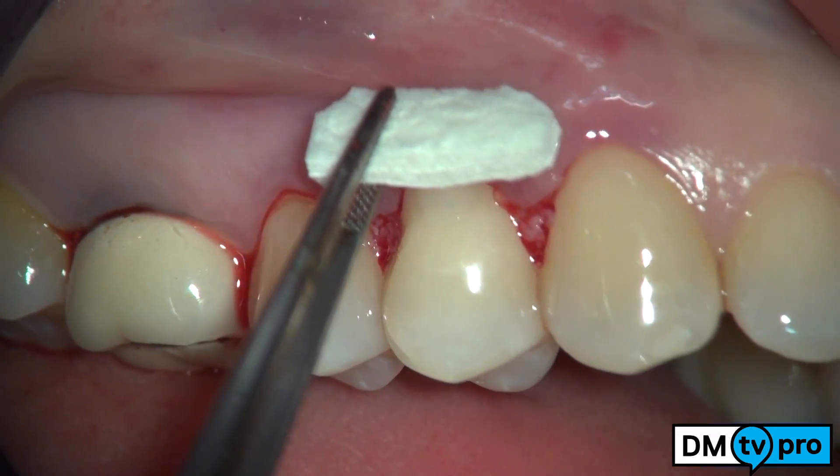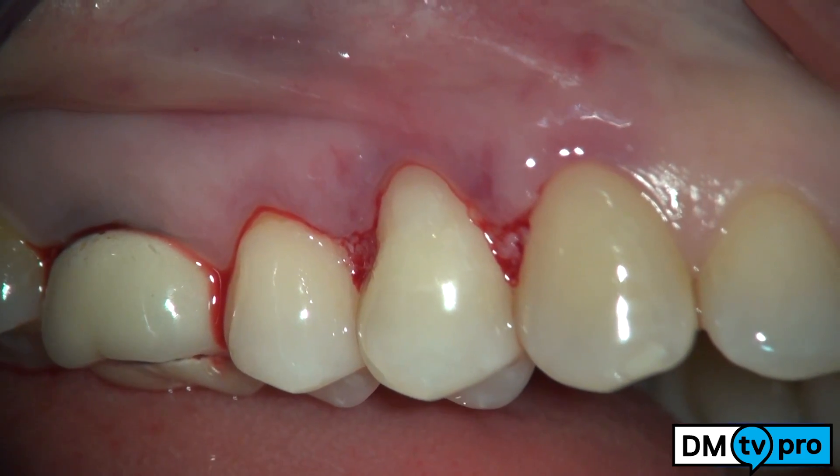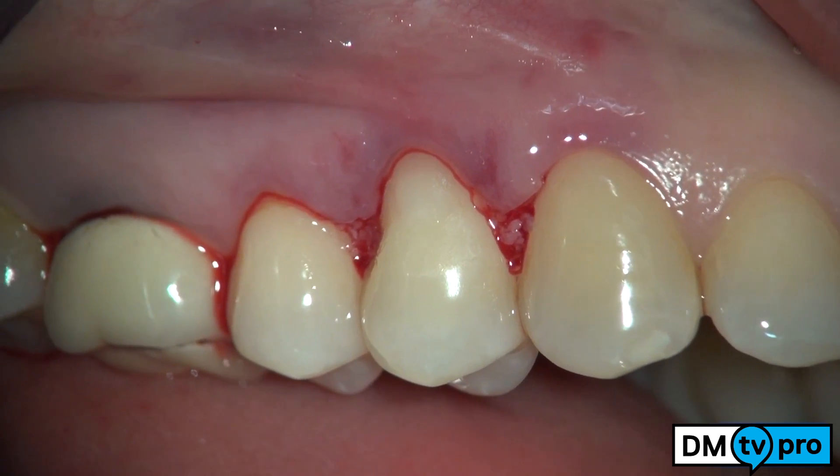A mucograft collagen matrix, properly trimmed in advance, is then secured with a single suture, both to the flap and to the recipient site.